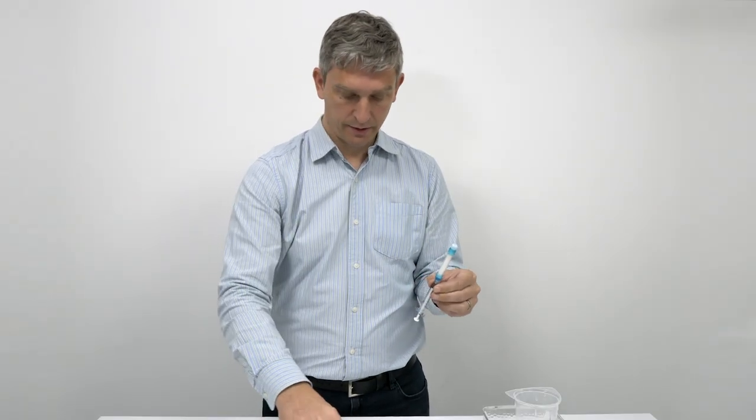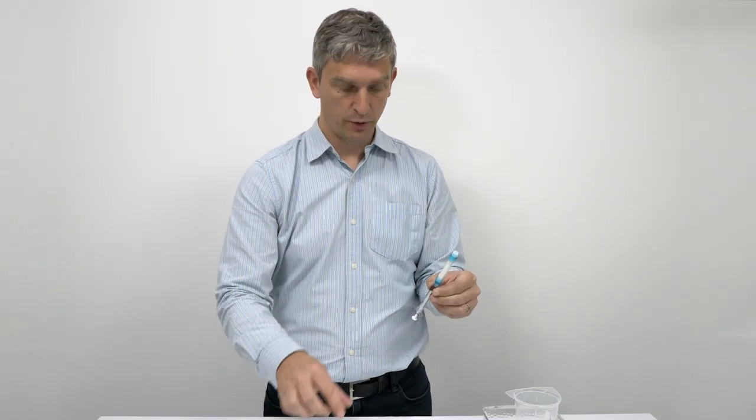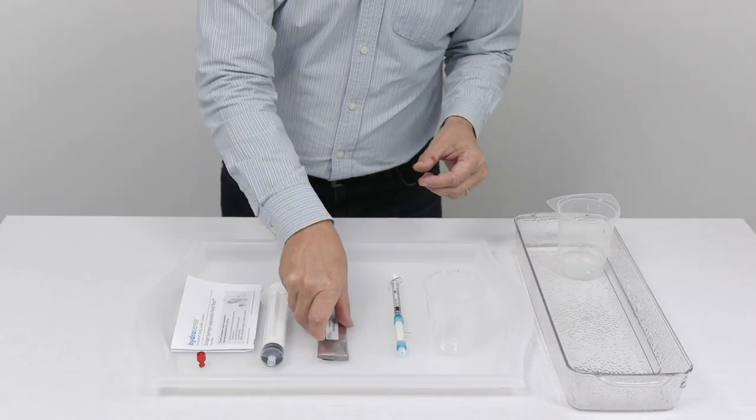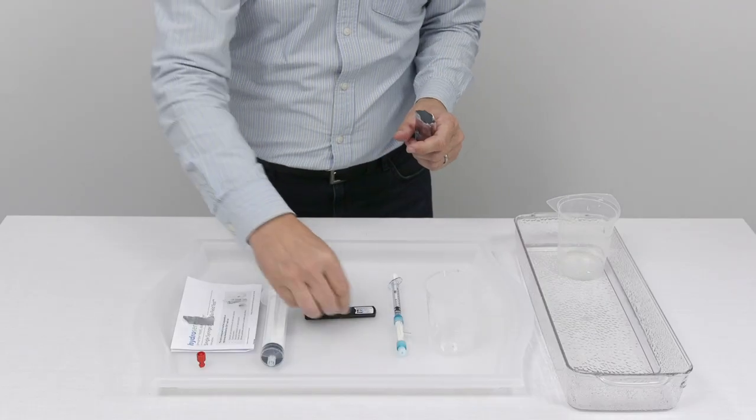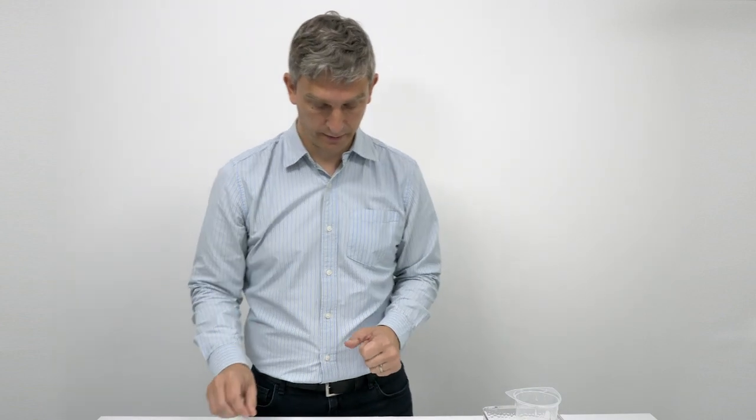So next we can take the test strip out of its foil packaging. It's important to only do this when you're ready to add the sample. The test strip is sensitive to moisture and therefore should only be removed prior to use. So we can open the foil, place this cassette on a flat surface. There's also a small dropper within the foil but we don't need that for this version of the test kit.